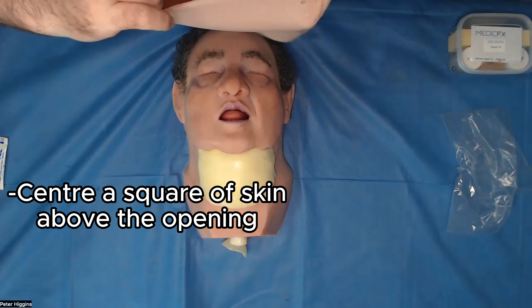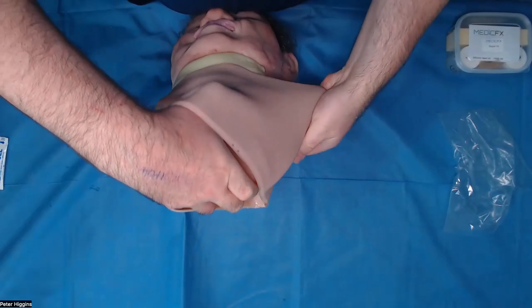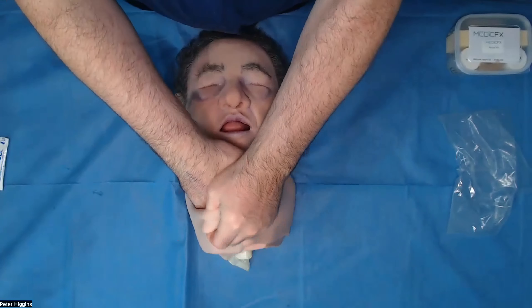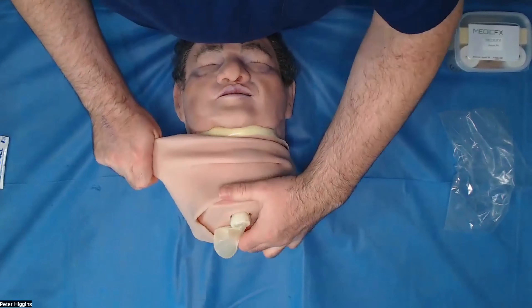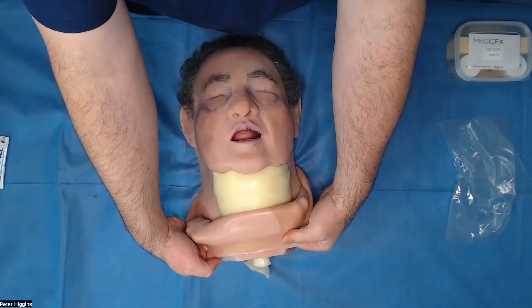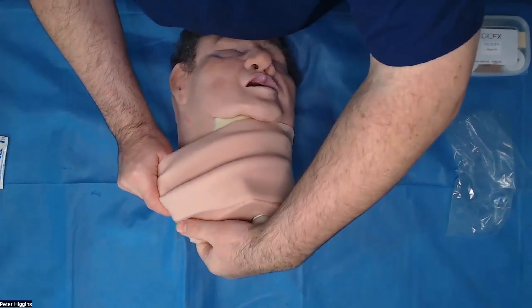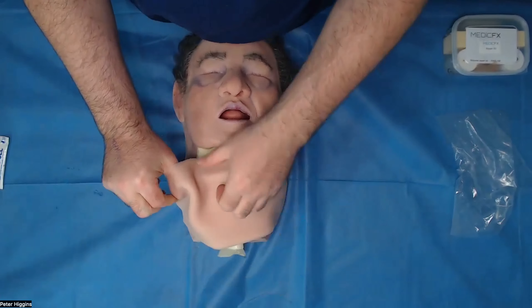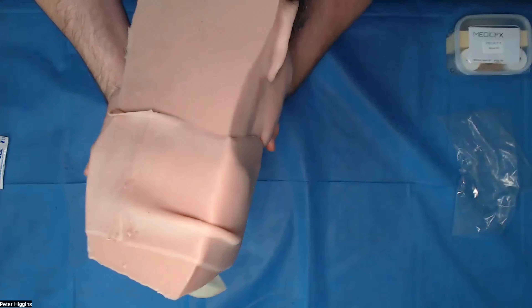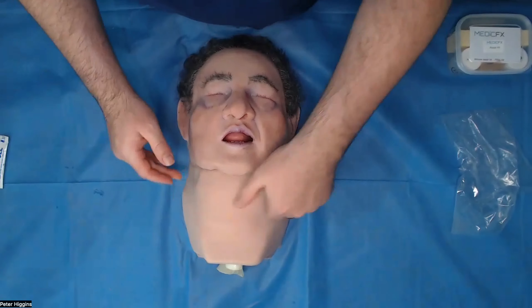Ensuring you have one of these squares in the middle, lift up the base of the model and encourage — this will be a little more difficult with the fat pad on now — encourage your skin over the base of the model here, just ensuring that you have the middle of the square over where your participants are going to be making the incision. Adjust the skin as you need to and that should fit nice and snug. That's nice and snug on there.